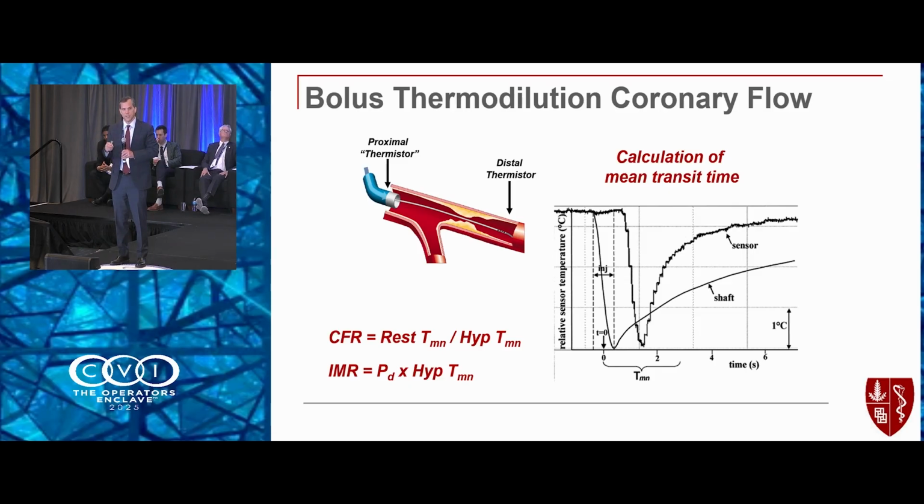And then with the appropriate software, the shaft of the wire can act as a proximal thermistor and measure the time that you inject room temperature saline, and that starts the clock. And then the distal sensor creates a thermodilution curve.